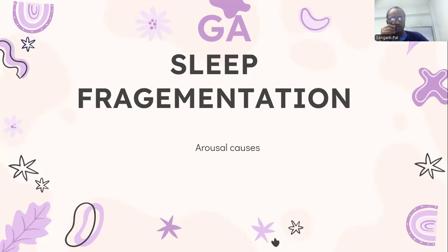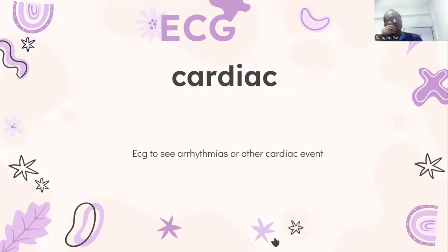also a spontaneous arousal index and a total arousal index. It can also be because of anxiety, depression. So maybe we have to involve our psychiatrist in this patient, and try to find out the reason for the patient's arousal, and that's why the patient is having excessive daytime sleepiness. The last thing which is also important is cardiac ECG, and it shows any pathogenic arrhythmias or other cardiac event.